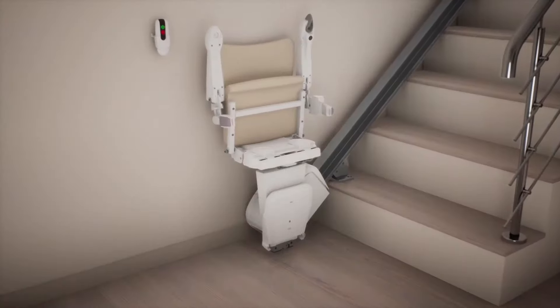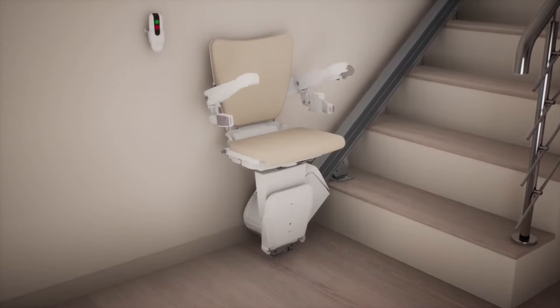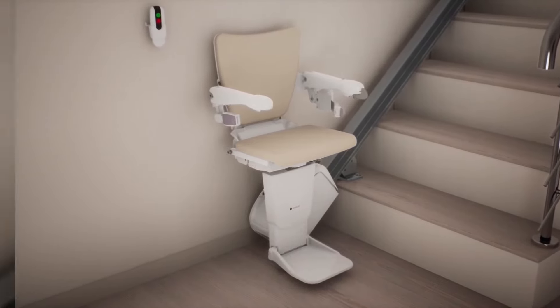Easy to use. Simply unfold the seat and the armrests. Take a seat and unfold the footrest by pushing the button. Make sure the seatbelt is fastened.